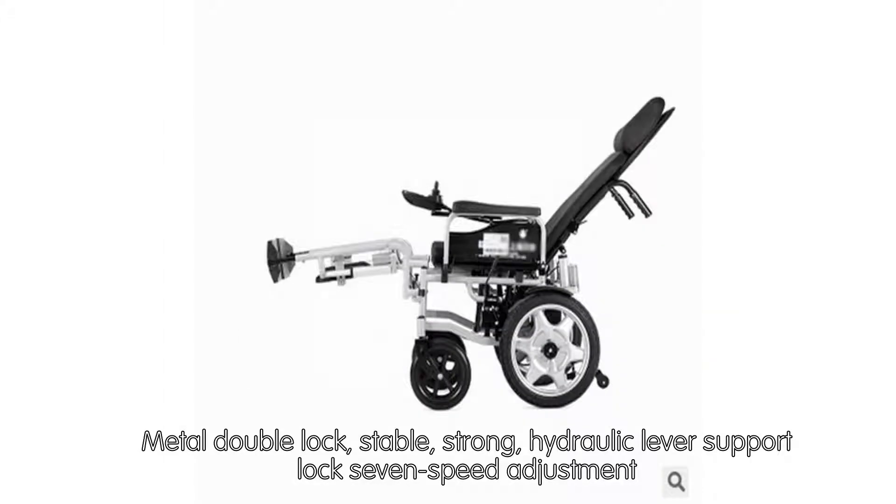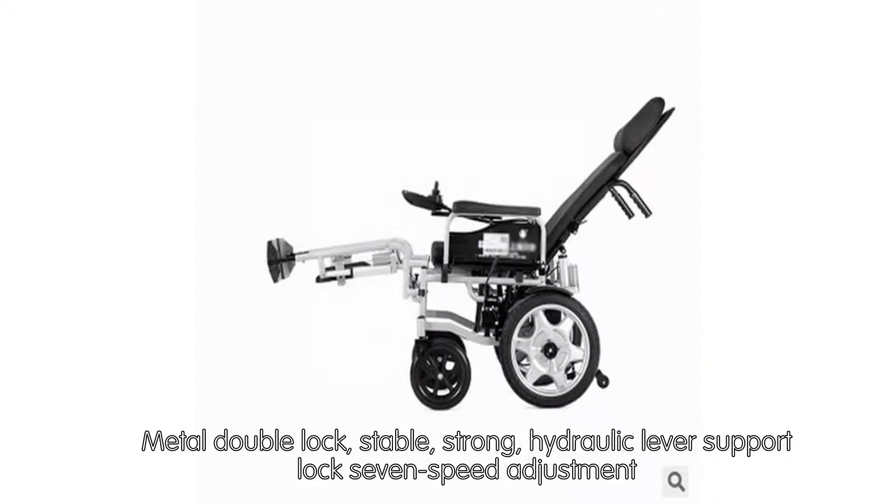Metal double lock — stable and strong. Hydraulic lever support lock with 7-speed adjustment.